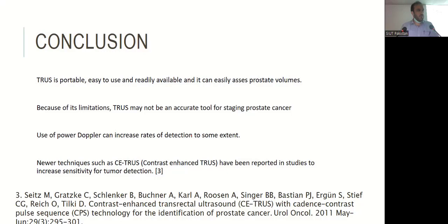If the prostate has a lot of blood supply, that means it may be in inflammation, maybe prostatitis. You can also have a ratio between the vessels and the parenchyma. There is a formula for it.